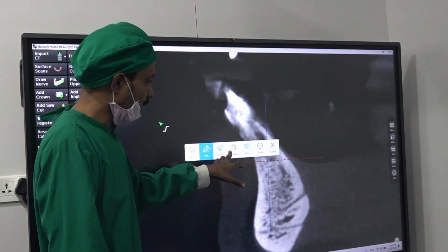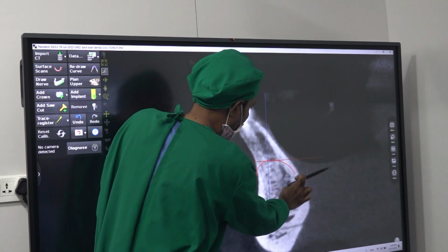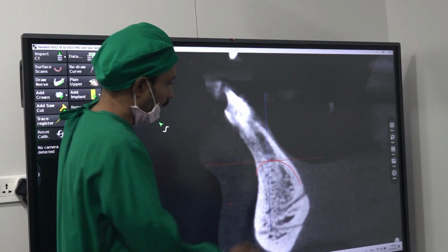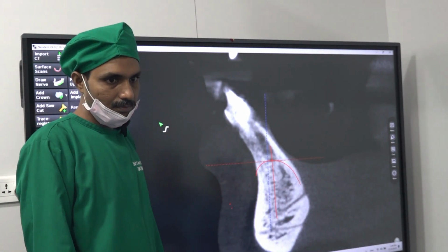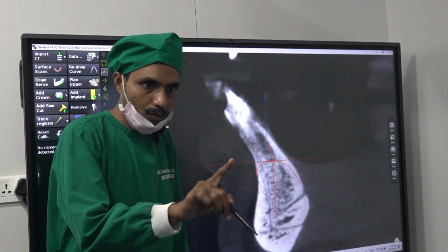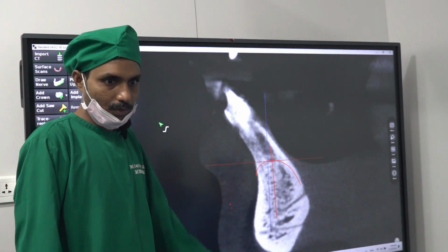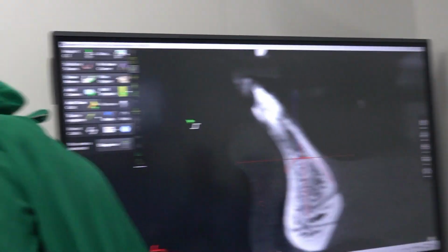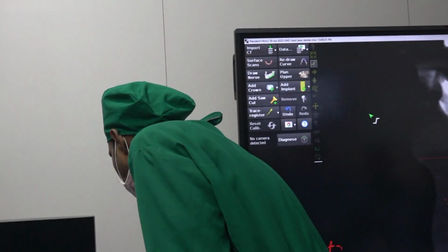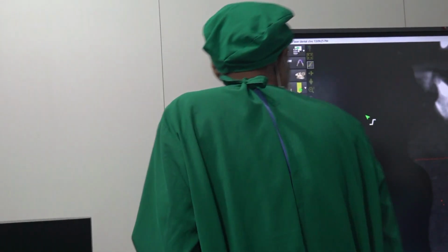The patient lost the teeth and was wearing a denture. The result will be like this. At that time you can drill straight, no problem. Of course, this vessel will only come in the midline, madam. You are seeing this foramen, right? This is only in the midline. If I go in the lateral incisor, this vessel won't come.